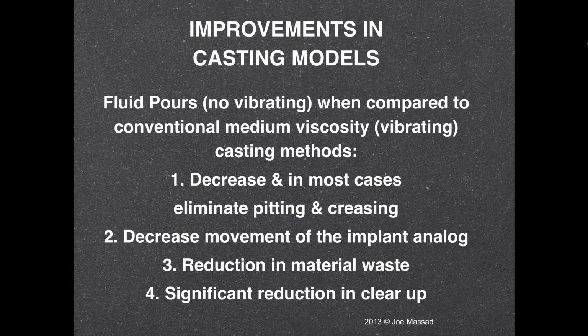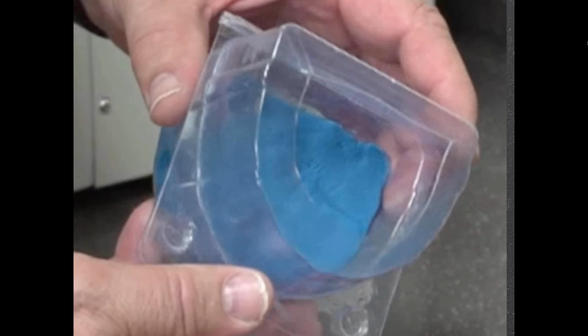So what do I have here? Well, I have a plastic container that generally they deliver models in, and we cut a hole on the top of it, and you see something blue in the bottom because I didn't have the right size, so I didn't want to have too much material in there, so I just use that as a spacer. But this is nothing more than a container that must be sealed off.